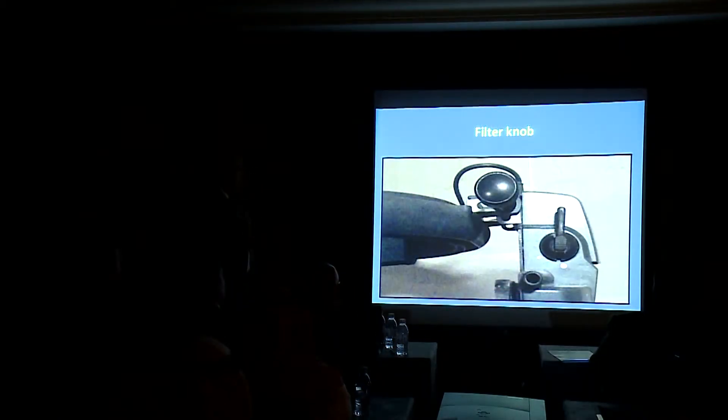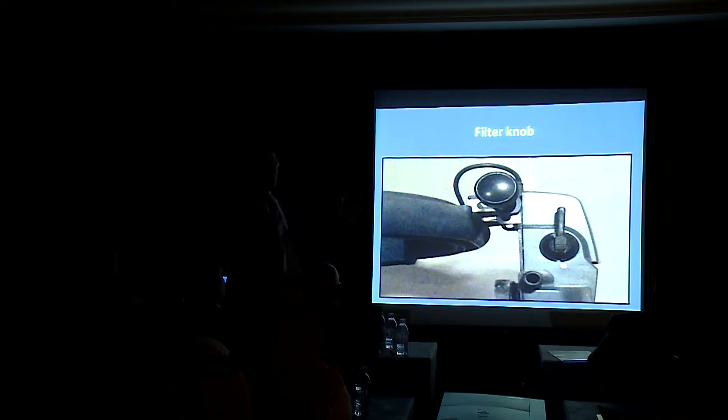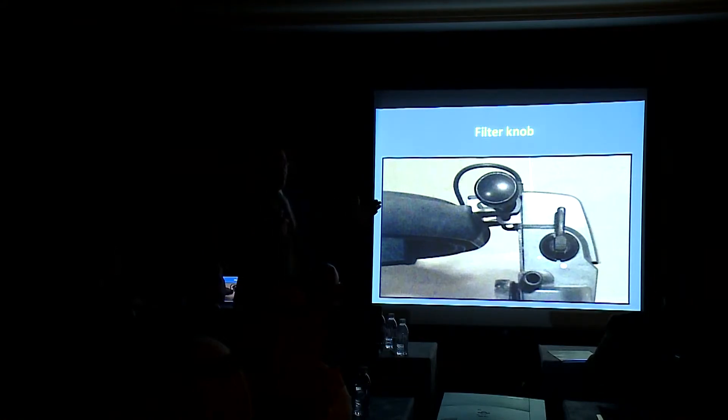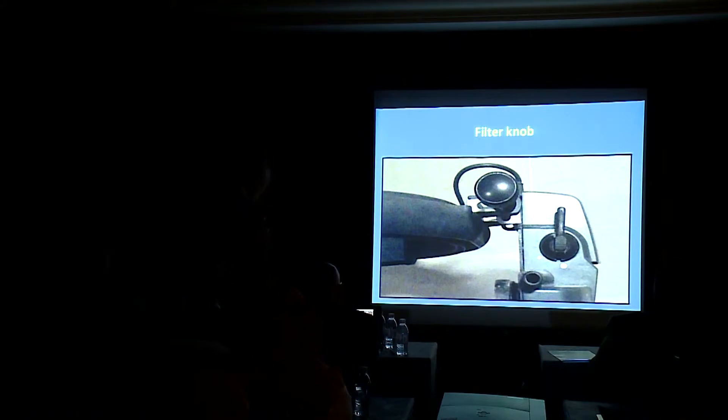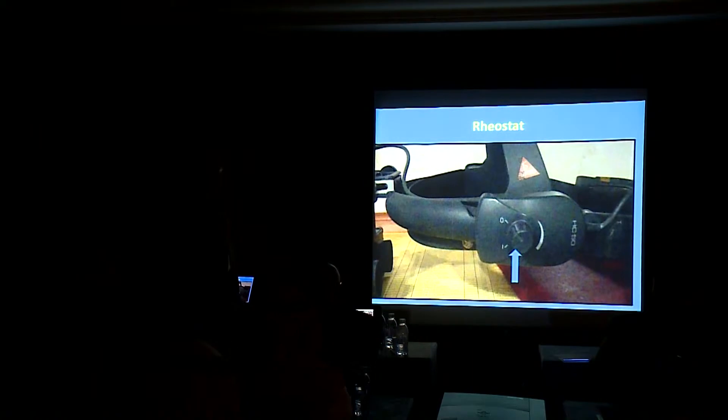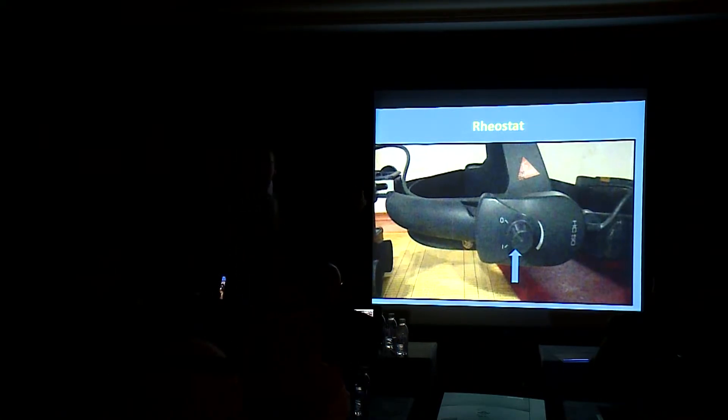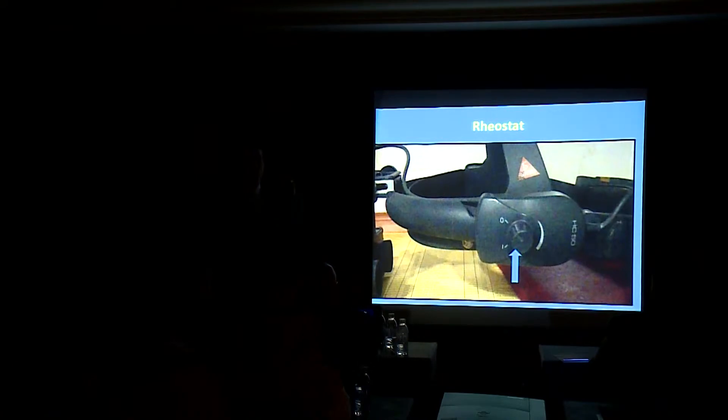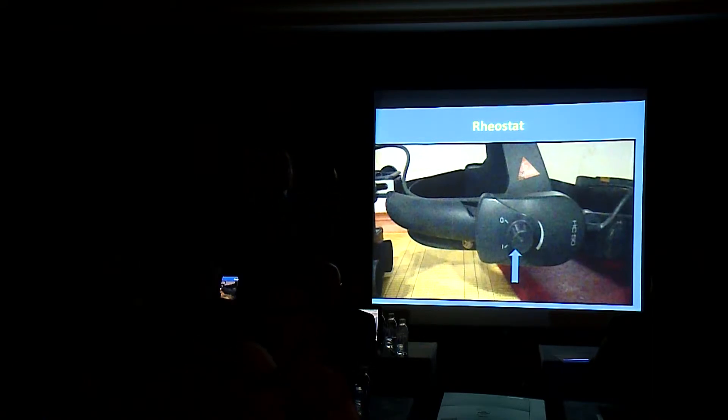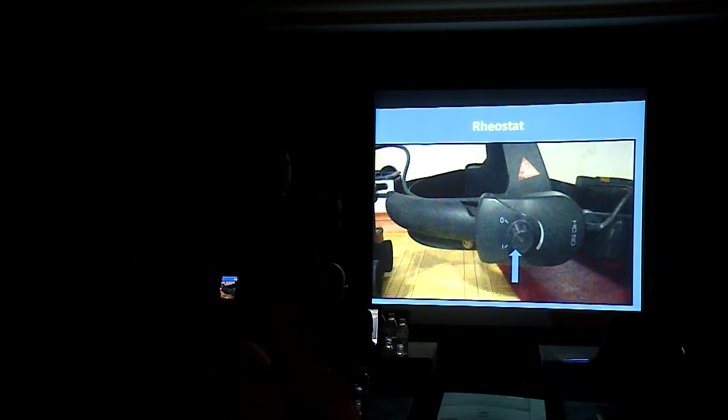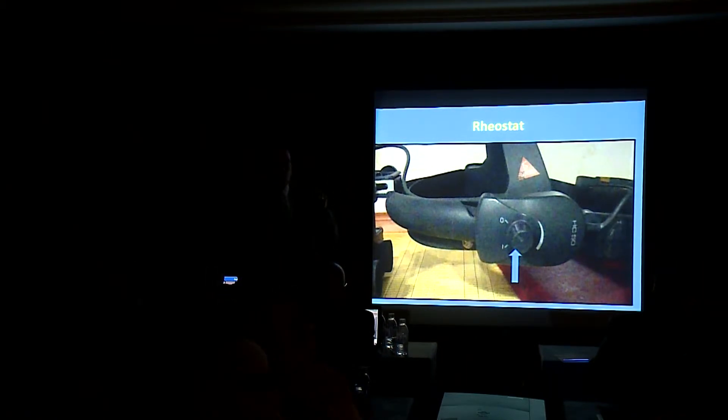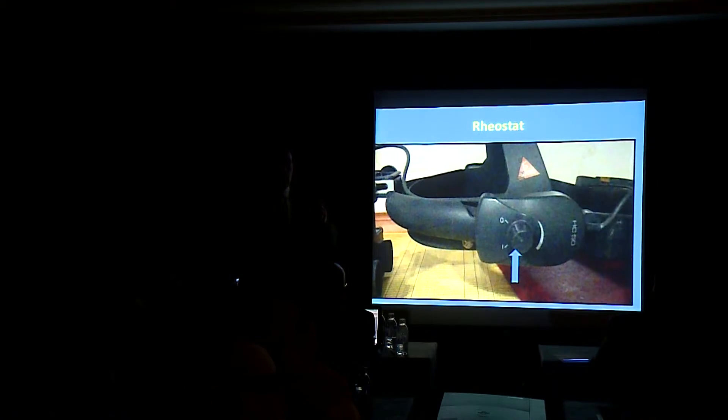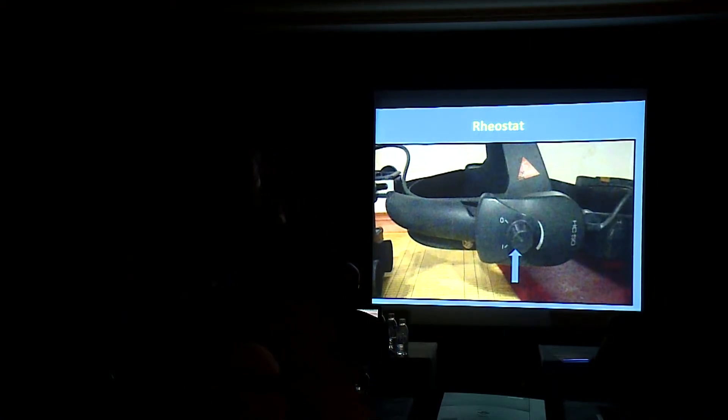Again, we have a filter knob to put red-green filters, cobalt-blue filters, or neutral density filters, and a rheostat to decrease and increase the intensity of light. Again, this is very important because if you want to put the light on the maximum to see the maximum, but actually if you put the light on the maximum and put it in the patient's eye, the patient will get very annoyed and you will lose the cooperation of the patient with you to get the needed information.